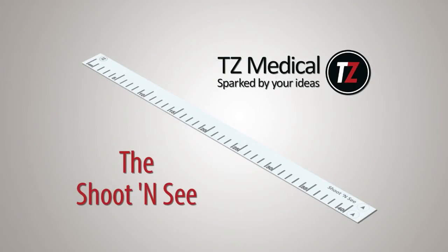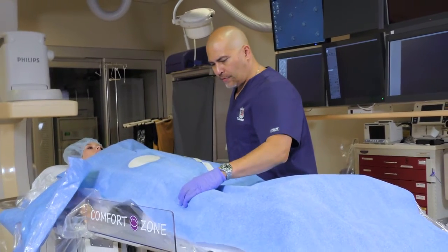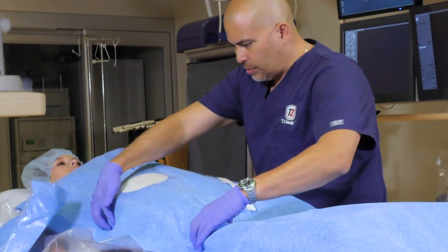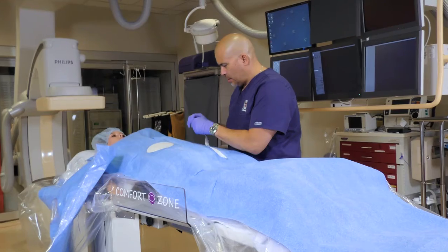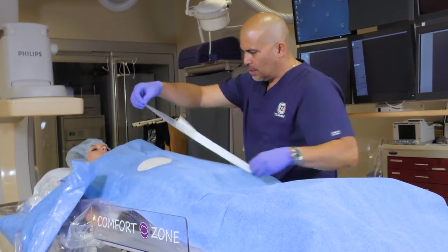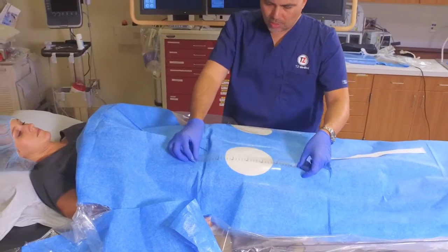One of TZ Medical's newest products, the Shoot and See, is a flexible, medical-grade tape for use during any vascular procedure involving radiography or fluoroscopy. Applied to the skin or drape before the procedure, the radiopaque markings are visible both to the eye and under fluoroscopy, which allows for quick cross-referencing between the inside and outside of the patient's body.